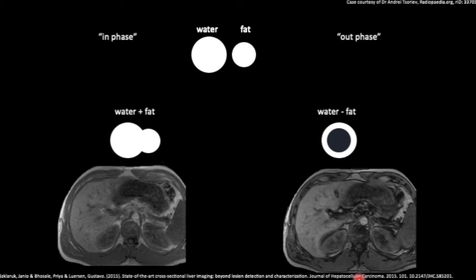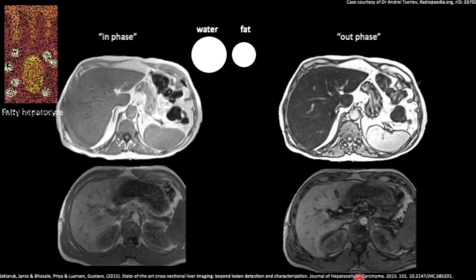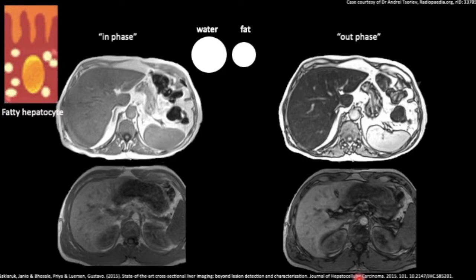Let's take a second example. In-phase here and out-phase here on the right. This time, the out-of-phase image here shows signal drop. This is because the water and fat occupied the same voxel, in this case of fatty infiltration.